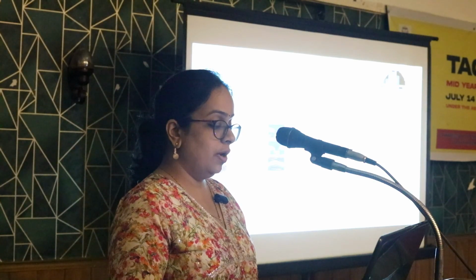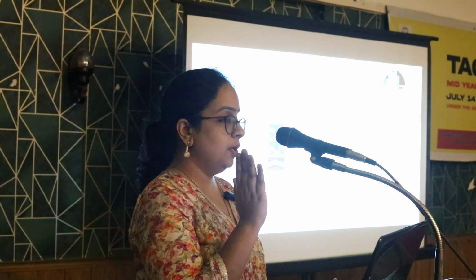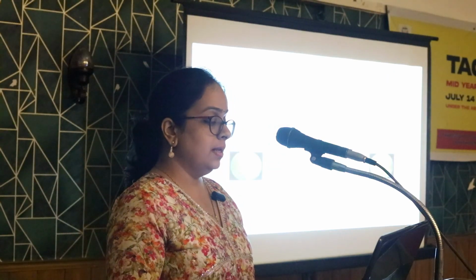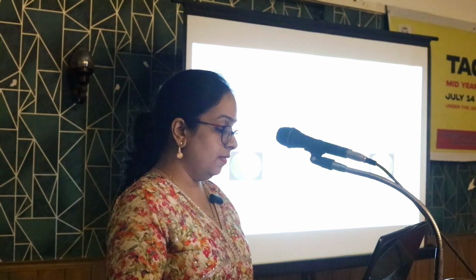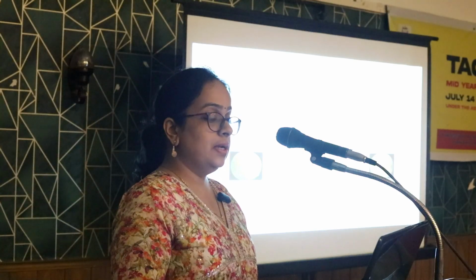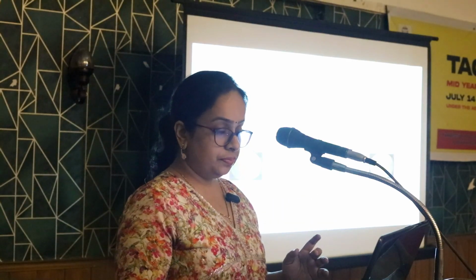So we have to look for a field defect in this area, and the patient is having a field defect in this area. So there is a correlation between the structural damage and the functional damage, which is more suggestive of glaucoma. Similarly, in this case, there is an RNFL defect and a corresponding ganglion cell defect, and this is the area where there can be a field defect, and the patient is exactly having a field defect in this area. So this is a correlation between the structure and function.